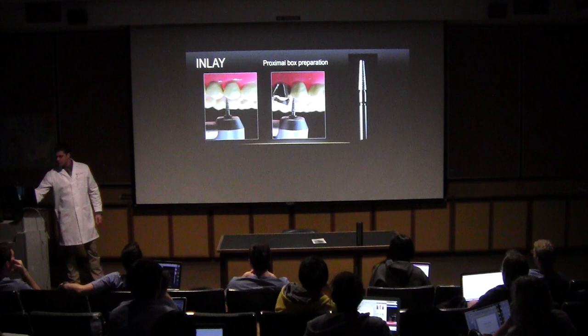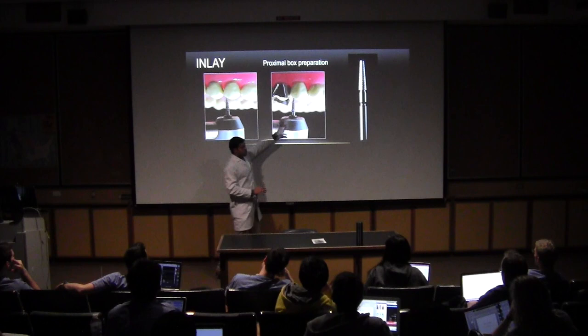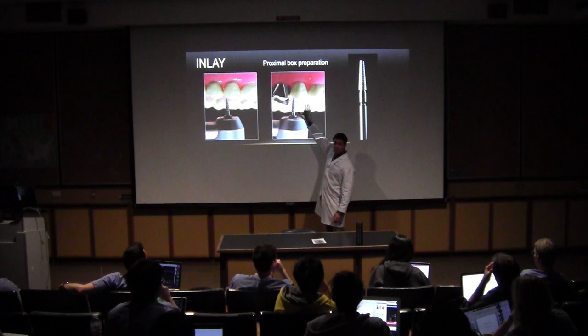Let me go back here and explain to you. To do the proximal box, remember to keep the long axis of the diamond point parallel to the long axis of the tooth, okay? And drop and shave down the proximal boxes, all right?